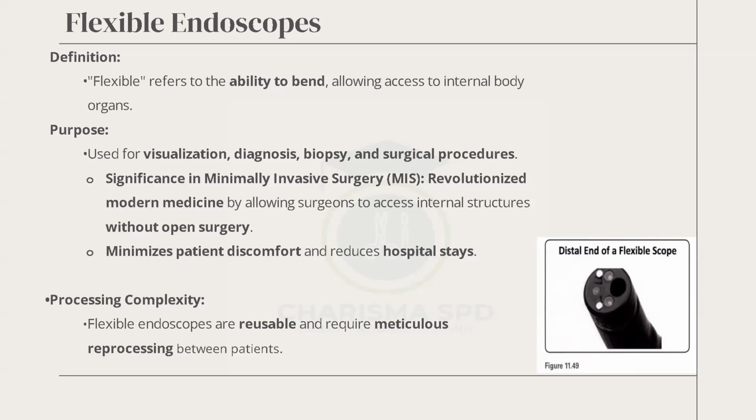Okay, so that is how the tip of a flexible endoscope looks. This one was magnified several times, that's why we are able to see all this. It might be either a gastroscope or a colonoscope. It looks more like a gastroscope, which goes through your mouth.